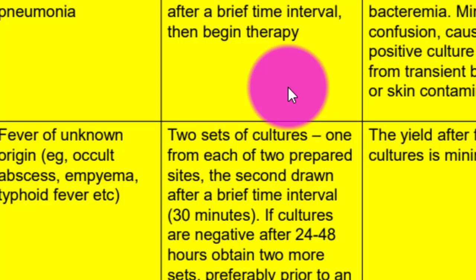Before beginning the therapy, we take the blood sample and try to culture the microorganism. After 48 hours, after 2 days, we try again. If it's negative, then we can say yes, this is negative.